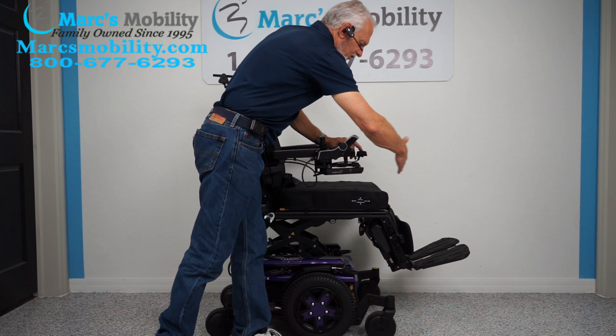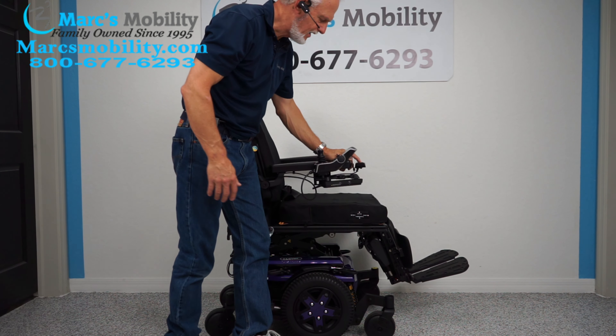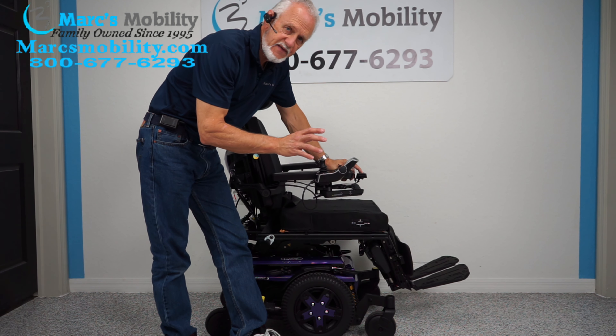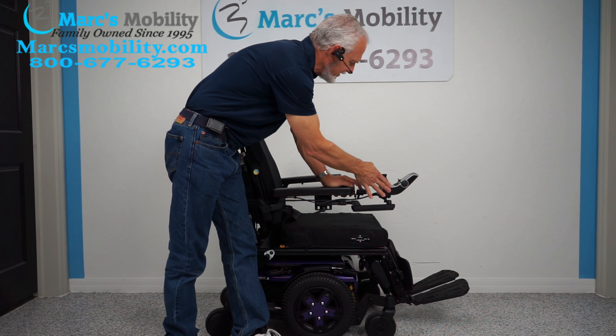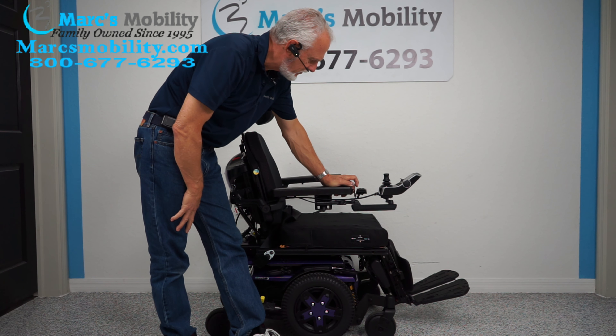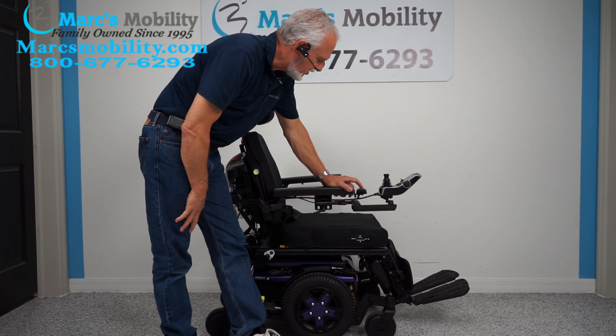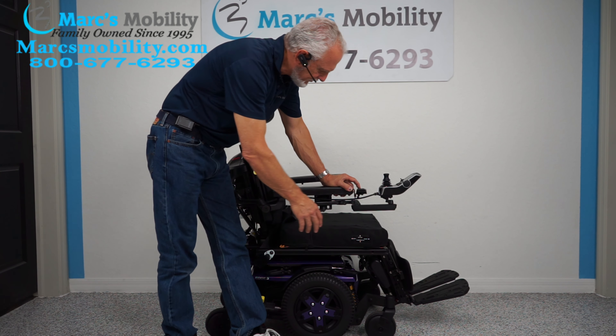I'm going to bring the seat back down. While the seat is going down, let's talk about the swing away joystick. This enables you to get a lot closer to a dining table without having to raise the arm up. This chair is set up for right-hand control, so if you're left-handed, we can switch everything to the left side and the joystick will flip to the left side.